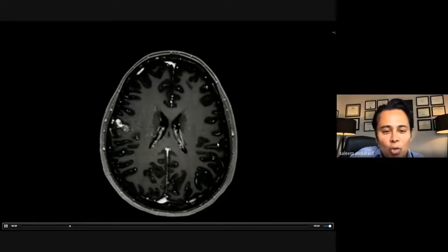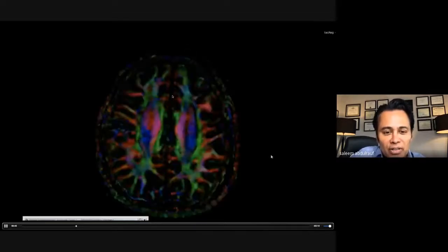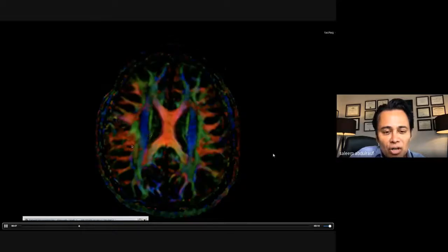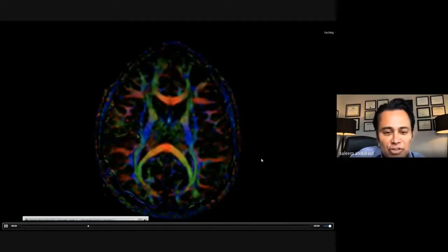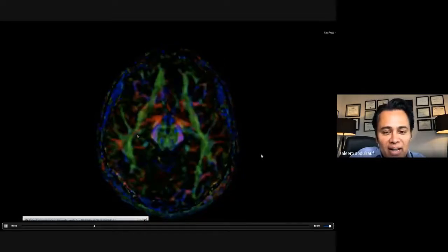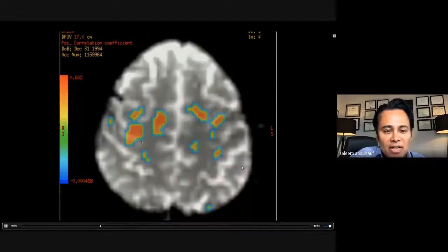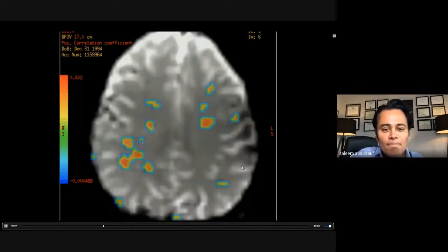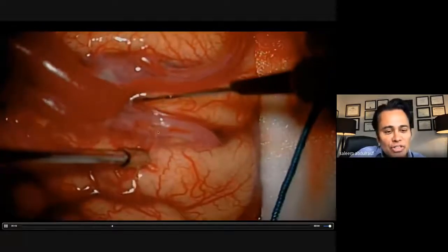So how are we gonna handle this situation? Okay, how am I gonna know 100% for sure in surgery? This is showing you the functional and showing you the tracts, showing you the AVM is just next to the internal capsule, which is, of course, a concern in this case, okay? So what is the situation we got in our hands and how are we gonna make this safe? This is a functional MRI showing you the AVM nidus is right in the motor strip itself, okay? Fine, all right, so not an easy decision, but this is the central sulcus here, okay?